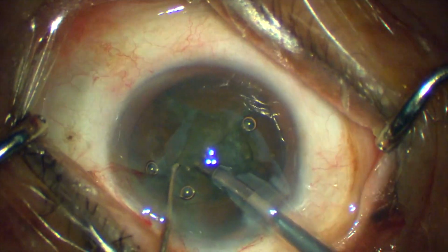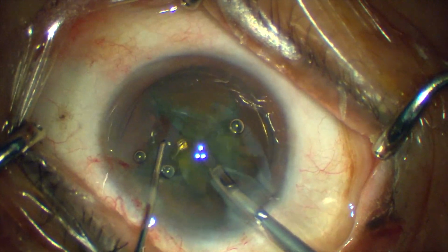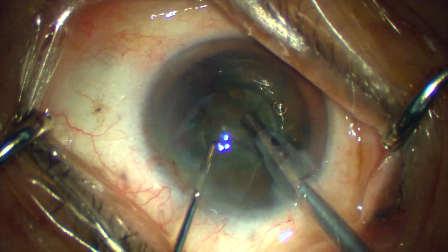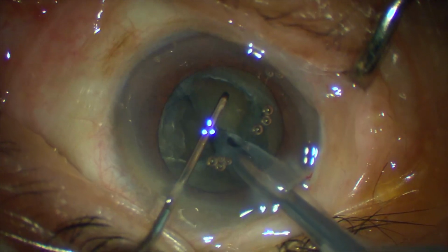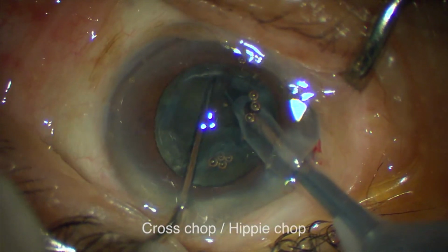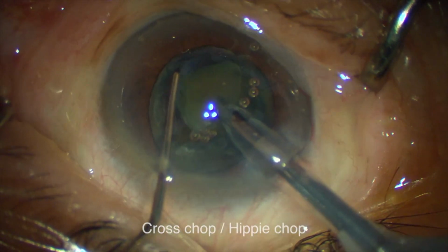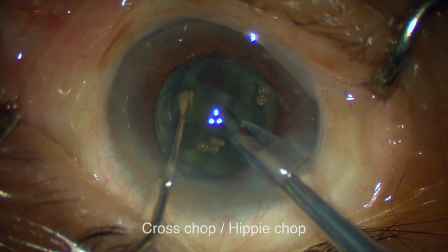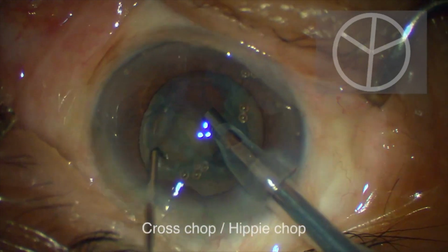Lens rotation is sometimes difficult even with proper hydrodissection, especially in the soft nucleus. With this new chopper, you can divide the nucleus easily, making cross-chop or hippie-chop, dividing the lens into quadrants without lens rotation. This new chopper helps wonderful hippie-chop, which means lens quadrantation into hippie mark shape, and it does not require hydrodissection or lens rotation. No vacuum. Chopping from the equator to the side of the phaco tip at right angle makes the lens quadrantation.